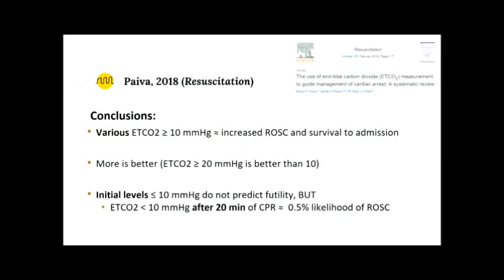However, if you're looking at the 20-minute point, you've been having ongoing CPR and you see an end-tidal CO2 less than 10, that does predict futility. There's a 0.5% likelihood that that patient, after 20 minutes, is going to achieve ROSC, and it's likely good in your armamentarium, along with ultrasound, to call this as a code.